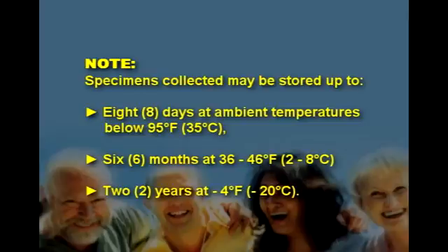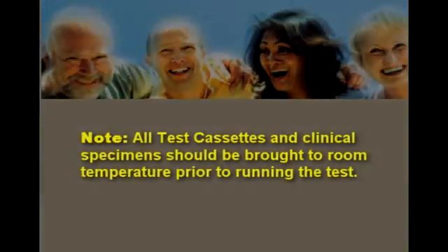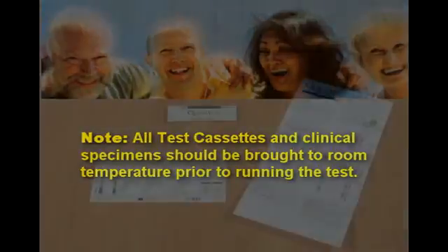Note: specimens collected may be stored up to 8 days at ambient temperatures, below 95 degrees Fahrenheit, 35 degrees Celsius, 6 months at 36 to 46 degrees Fahrenheit, 2 to 8 degrees Celsius, or 2 years at -4 degrees Fahrenheit, -20 degrees Celsius. Note: all test cassettes and clinical specimens should be brought to room temperature prior to running the test.